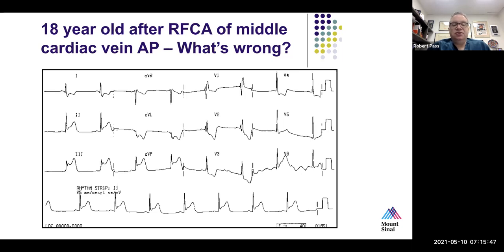Those are power controlled catheters. You choose how much power you want to deliver, and it doesn't matter as much what the temperature is, but you always need to be concerned with those catheters. They make much deeper, much larger radiofrequency lesions than standard RF current. And that's the reason why most electrophysiologists do not use that catheter with irrigation running for most of their standard ablations. But this is an area where, if cryo were unsuccessful, or if with regular standard RF you could not achieve an adequate power, some might use an irrigated catheter with a low power, maybe 20 watts. But even at low power, there's a risk for perforation or for injury to a coronary artery from ablation. This is one of the reasons why ablation in this region, particularly in the middle cardiac vein, is associated with a high recurrence rate and is very challenging.